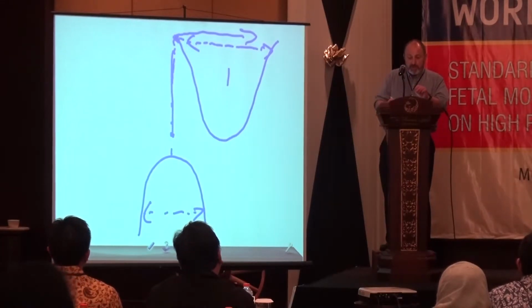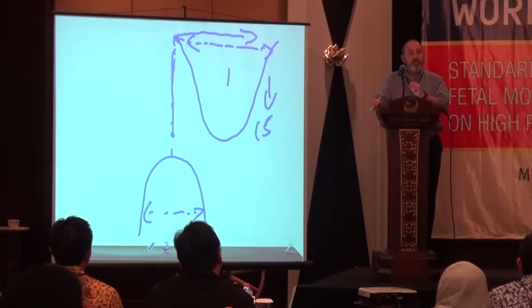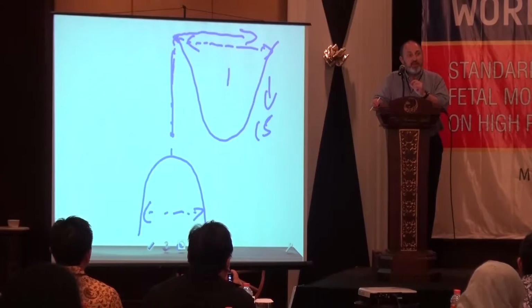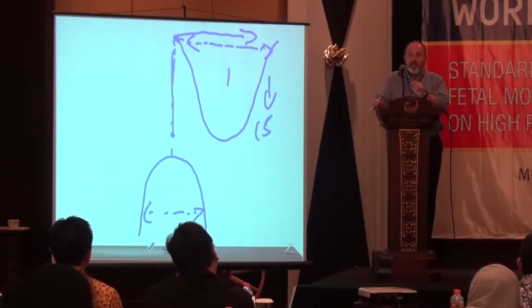The fetal heart rate drops by more than 15 beats, and it must last 15 seconds or more. But you can have a deceleration pattern, which I will show you on the slides, where none of the decelerations go down by more than 15 beats.